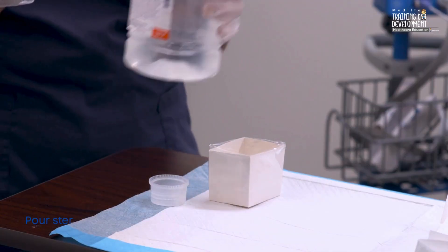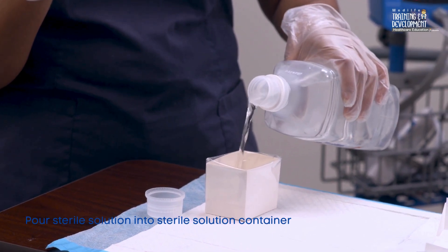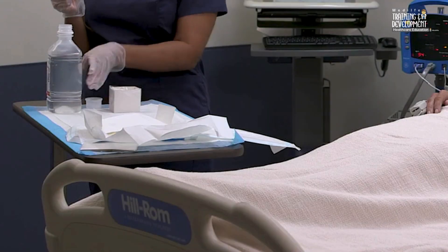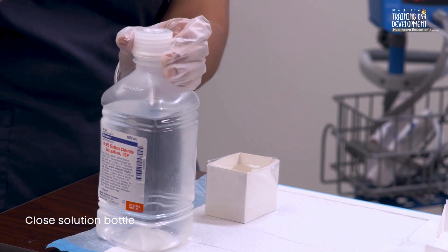Using your non-dominant non-sterile hand, pour a small amount of sterile solution into the sterile solution container. Close the solution bottle using your non-dominant hand to prevent contamination and spillage of the solution.